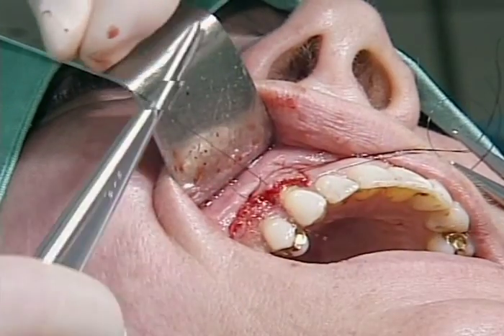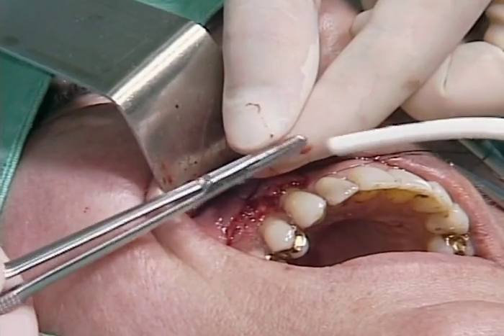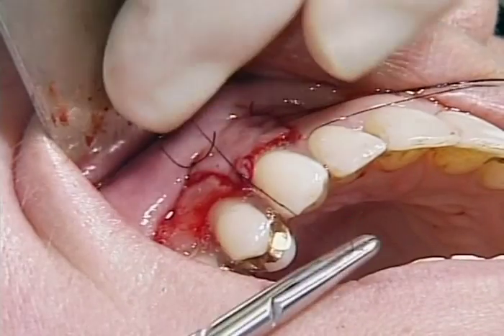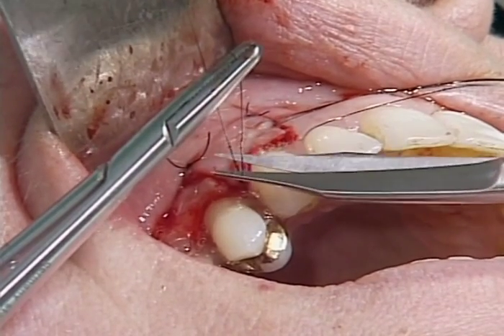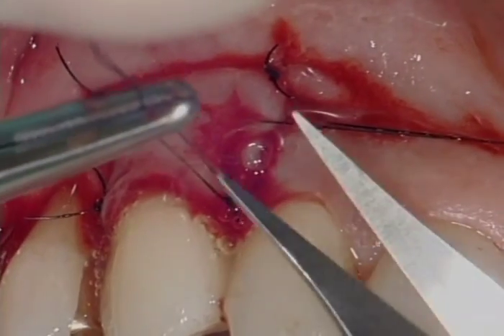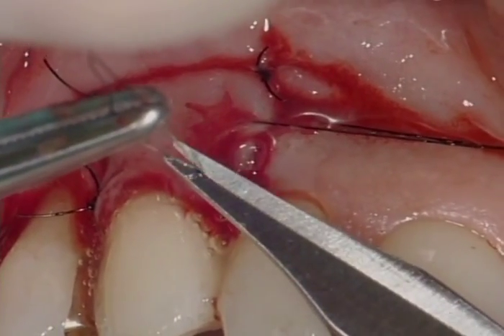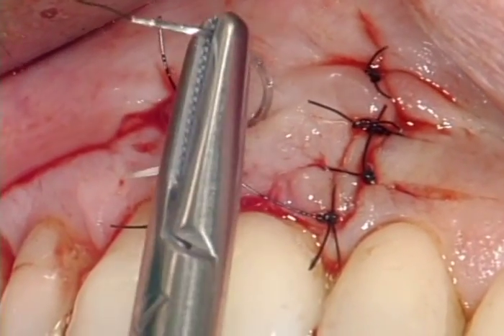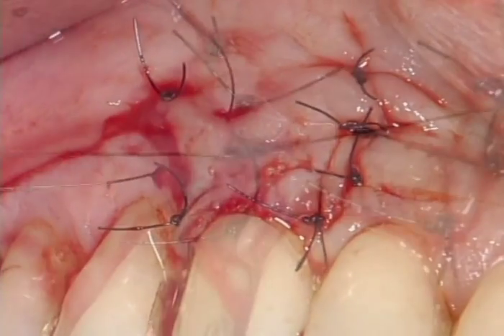The prepared sutures are now tightened. The flap is repositioned coronally and secured, covering the entire defect. It must be verified that the wound closure is tension-free. At this stage of the surgery, the assistance of a well-trained nurse is very helpful. The suturing is completed between the horizontal and vertical incisions.